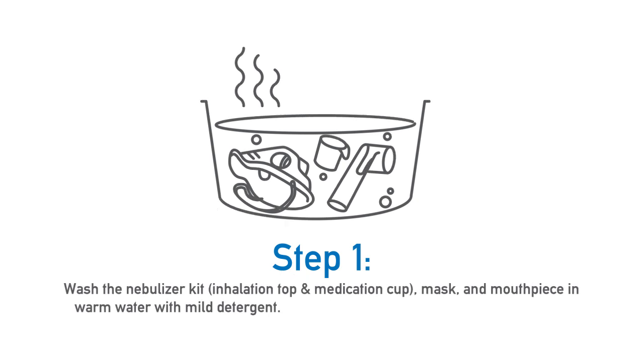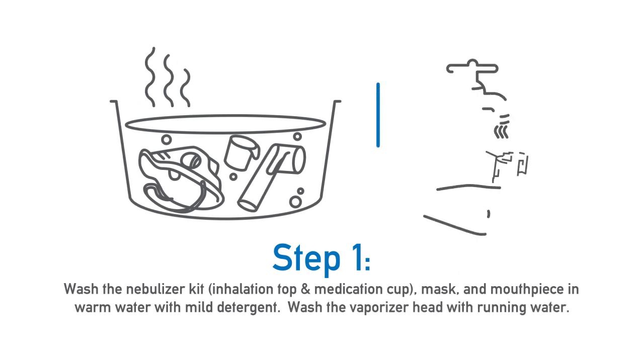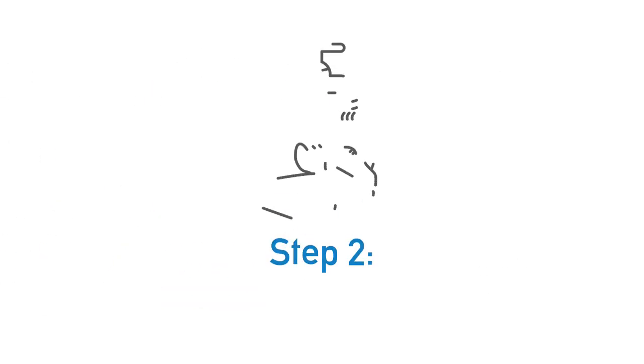First, wash the nebulizer kit — inhalation top, medication cup, mask, and mouthpiece — in warm water with mild detergent, and the vaporizer head with running water.